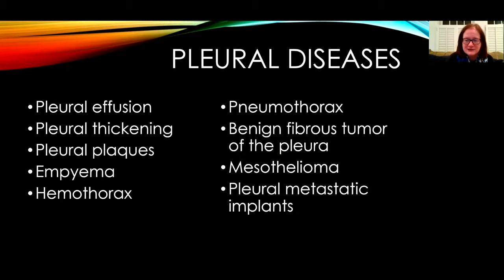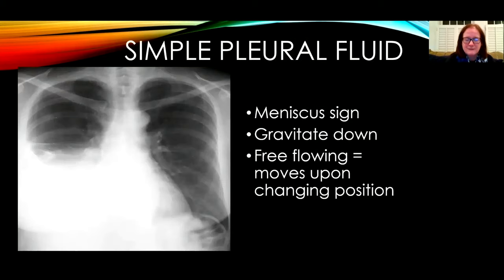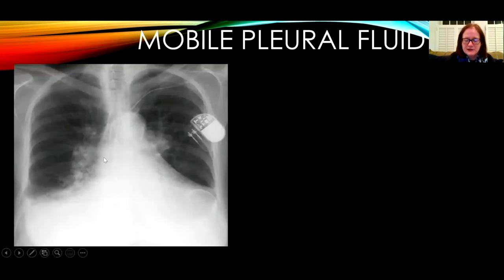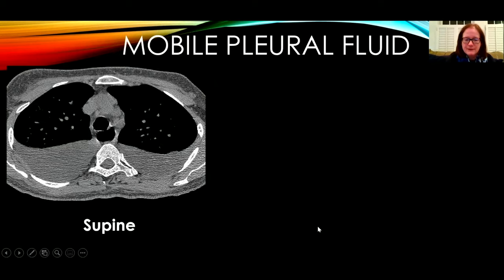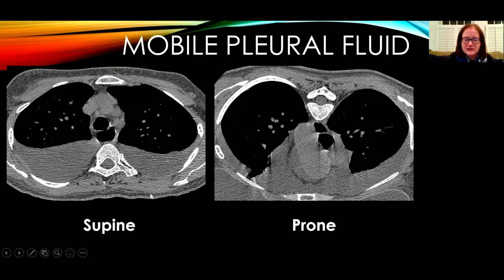We're going to look at the following pleural diseases on chest radiography. Simple pleural effusions tend to gravitate downwards, have a meniscus sign at the edge of the chest wall, and are freely mobile in different positions. This is a patient with a small right pleural effusion — on the decubitus position with the right side down, the fluid layers, indicating that it's mobile. Another patient on CT shows freely flowing pleural fluid making a meniscus sign and gravitating to a dependent location.